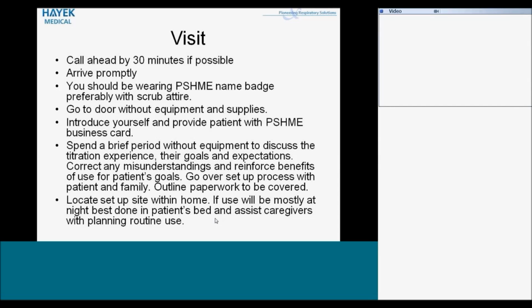So during that time, you'll probably be able to form a little bit of rapport with the patient. Locate the setup site. If it's going to be a bed, mostly at night, a nocturnal use device, it's best to do the setup at the patient's bedside. So find out where the patient's going to be using this, and assist the caregivers with planning routine use. They'll have to find a location near the bed next to the patient for placing the machine and a place to plug in with grounded outlets. All those things will have to be considered and help them to determine how they're going to make it work in their home.